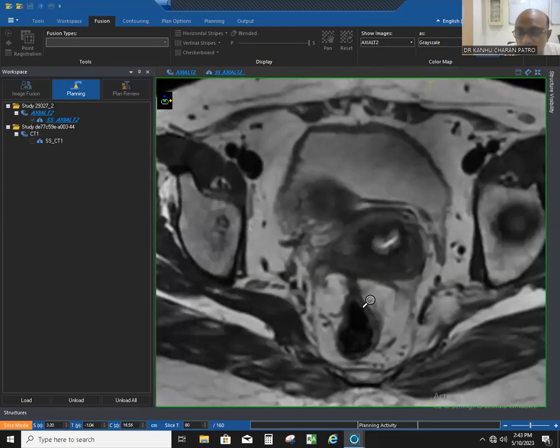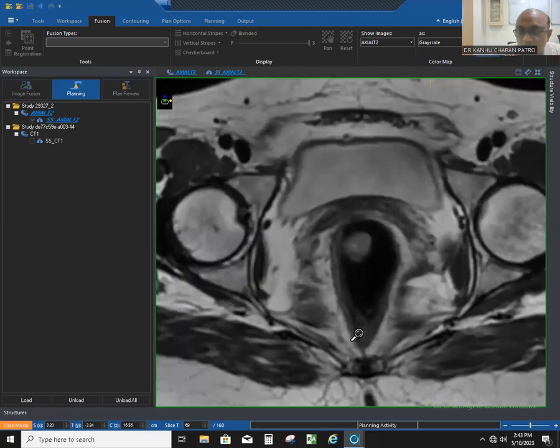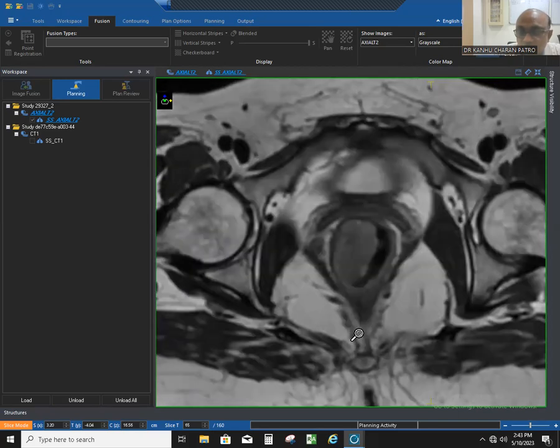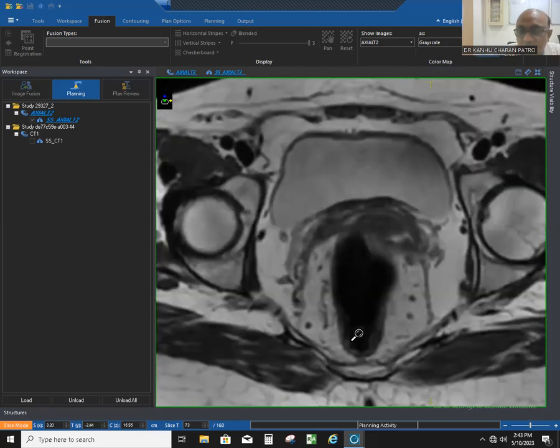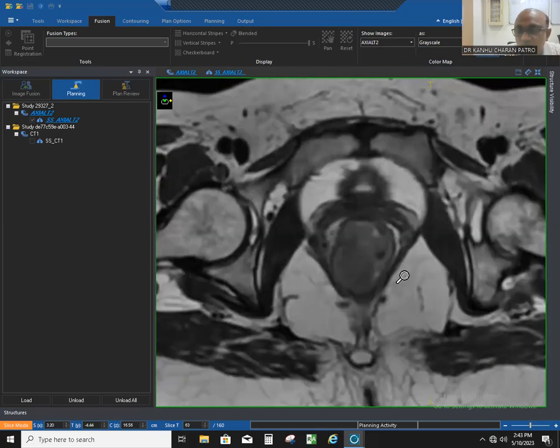You can see this is the rectum, this is the mesorectum, and this black line is the mesorectal fascia. These two muscles are known as the levator ani muscle, and the fatty tissue is the mesorectum.